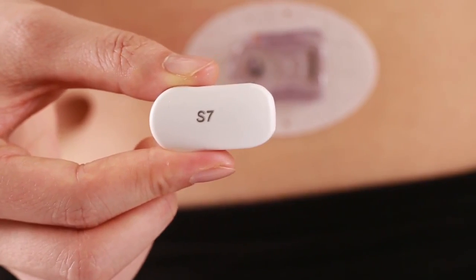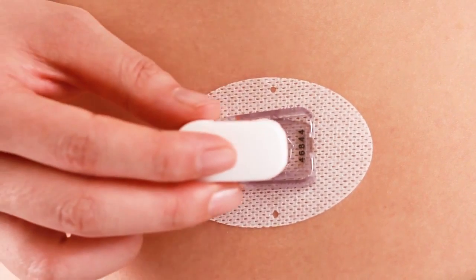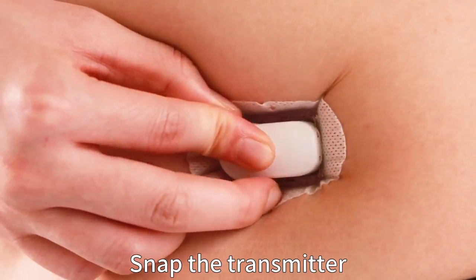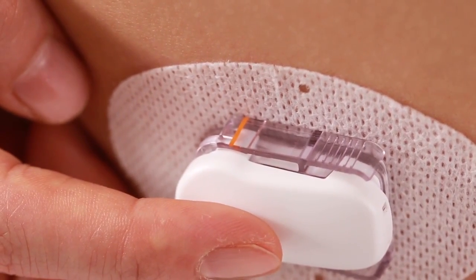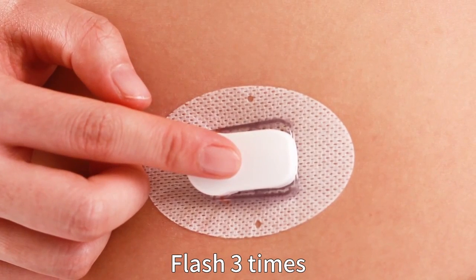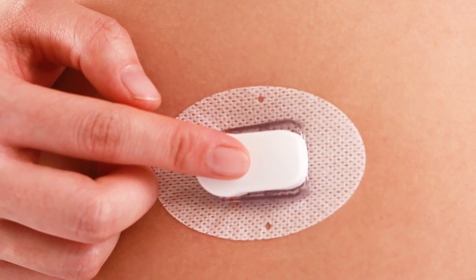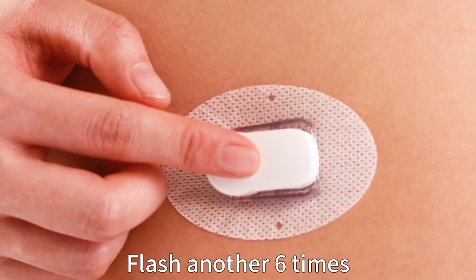Now it's time to attach the transmitter. Make sure you fit the round part of the transmitter into the sensor first. Keep the transmitter parallel to the sensor support mount, then snap it in. Make sure the transmitter is securely connected. The green indicator light on the transmitter will flash three times after successful connection, then flash another six times within one minute, indicating the system check has finished.